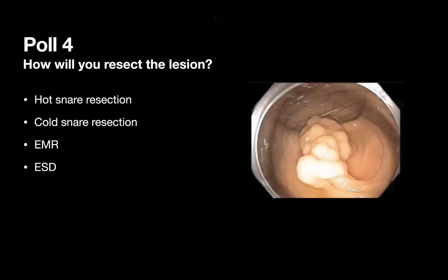Is Sriram's mic open or not? Yes, sir. I apologize for the delay. Sorry about that. Yeah. So what will you do, Sriram? Well, I would try to do EMR if at all possible, and once I inject, I would know better. Okay. All right.